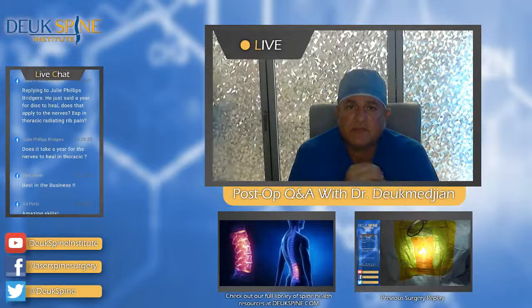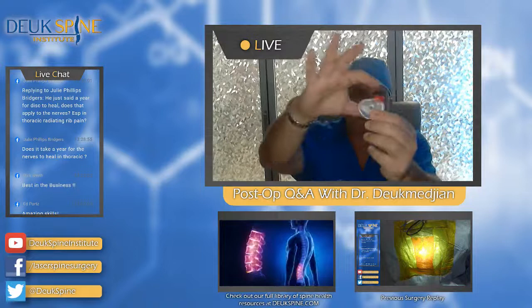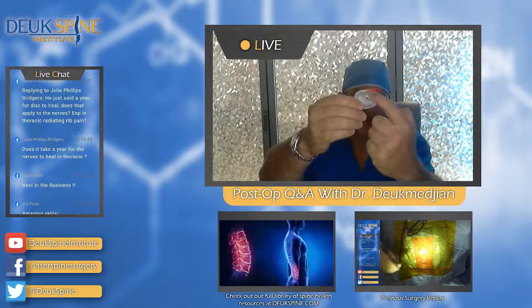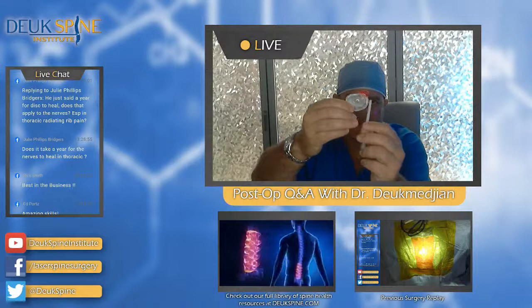in the annulus fibrosis. What that looks like, folks, so you understand, is right here. So this is a disc. This is the back of the disc. This is the front of the disc, sides. And basically I went through the disc with a little tube, okay? And I got to the base of the herniation and I used the laser to zap away all the herniation out of the foramen. This is the foramen where the nerve root is. And then I cleaned up the tear.